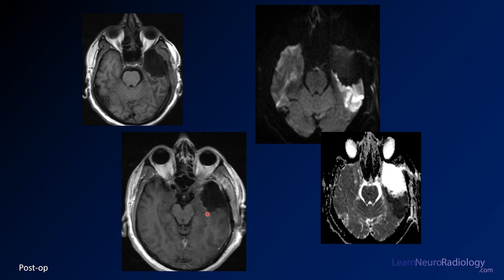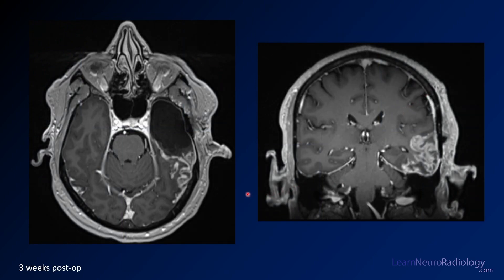Now we see the post-op imaging: pre-T1 and post-T1. He now has a resection cavity that looks pretty smooth and clean. But on diffusion imaging, there is a wedge-shaped periphery of abnormal diffusion posterior to the cavity — that's an area of infarct posterior to the resection. This patient had an infarct in the post-operative setting, probably contributing to his worsening symptoms. If you wait until three weeks and do post-contrast imaging, the patient now has gyral-form enhancement, much like you'd see in an infarct but looking different from tumor. It's important not to call this tumor progression — this is just gyral-form enhancement where there was previously an infarct, the evolution of a post-procedural infarct.